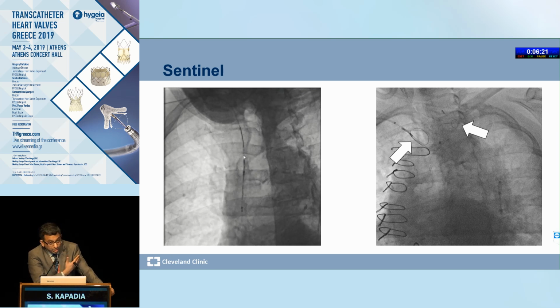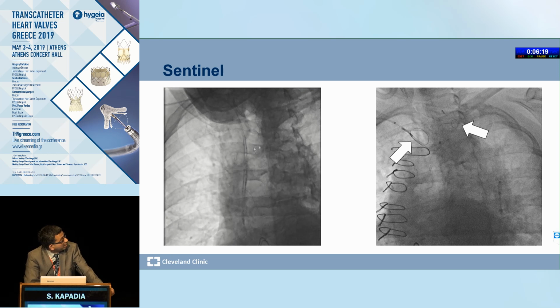this is live, so we didn't do any editing of the film. So here the calcium is seen there, so no need for dye.